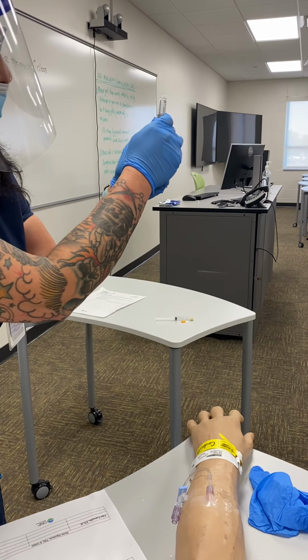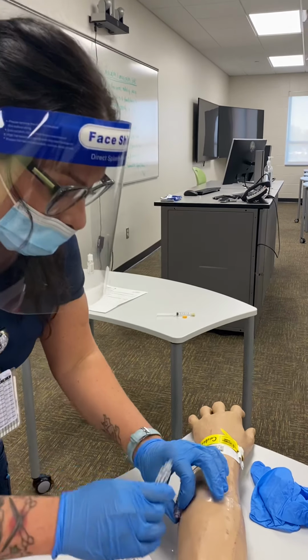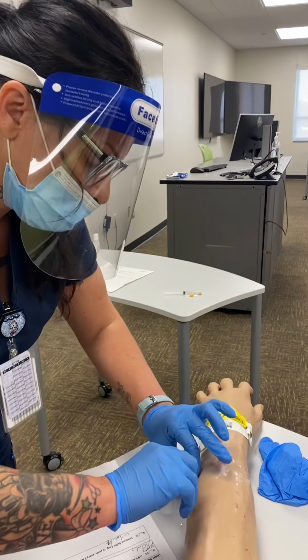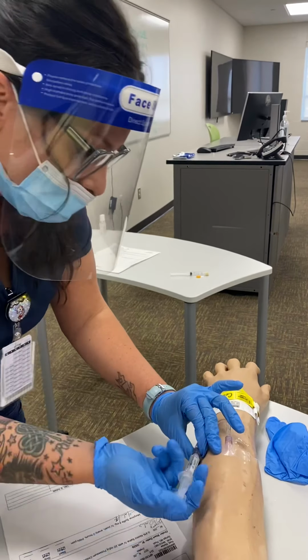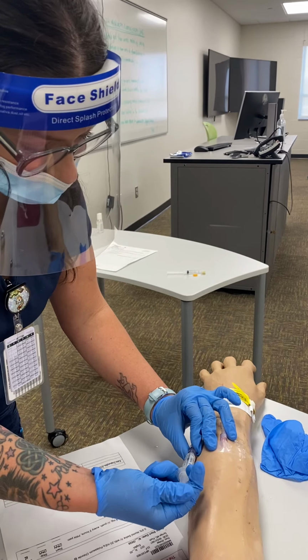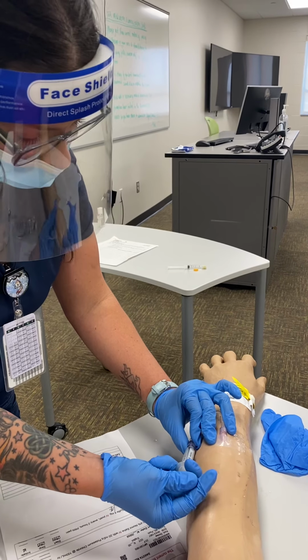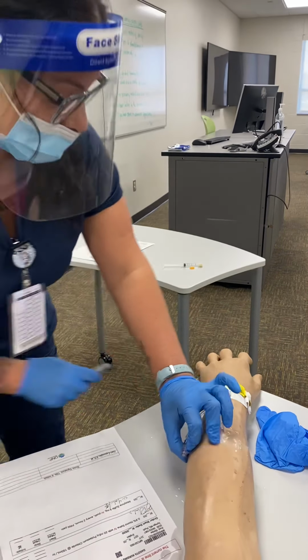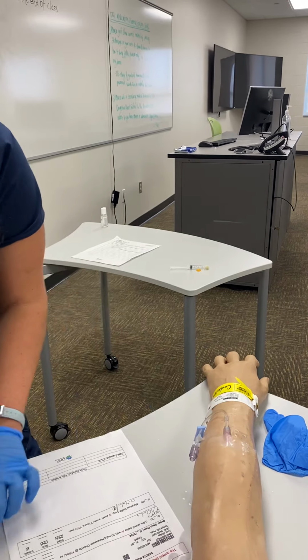Cool. You already know it's patent, so we're just going to go and push gently. Okay. All right.